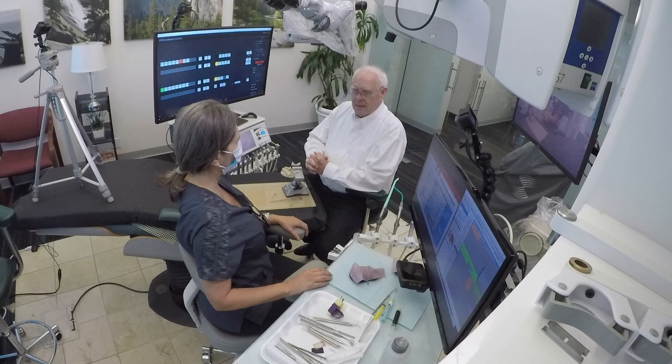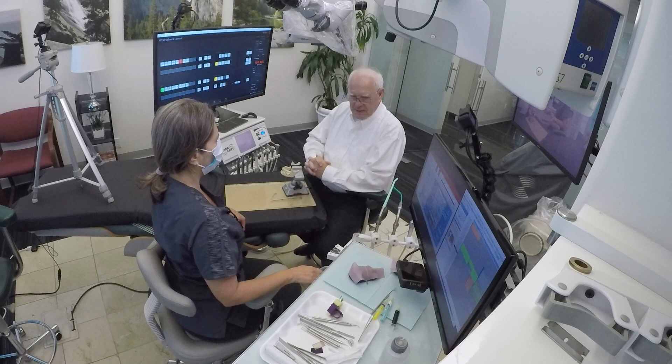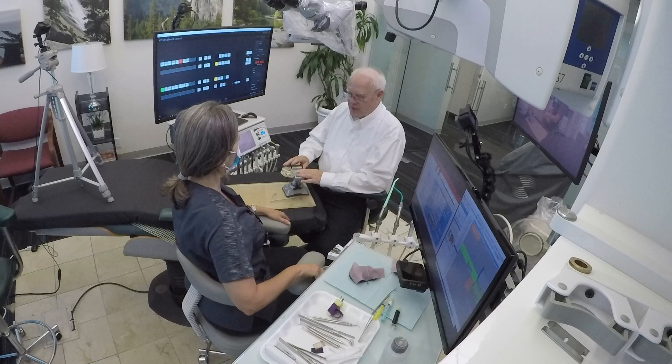As long as you're able to sit there comfortably like that, it's perfect. I've mastered my movement — Joy told me I have to move and then turn, because I'm still new to it. And then here I can come back, I can grab it here — never grab the patient.